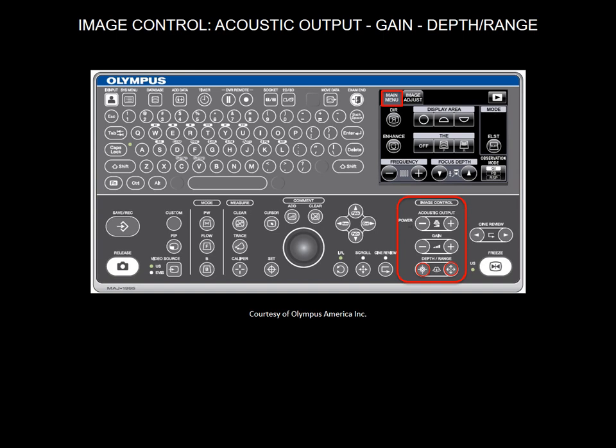The depth refers to the distance between the image structure and the transducer. The depth range keys can be used to magnify or shrink ultrasound images.